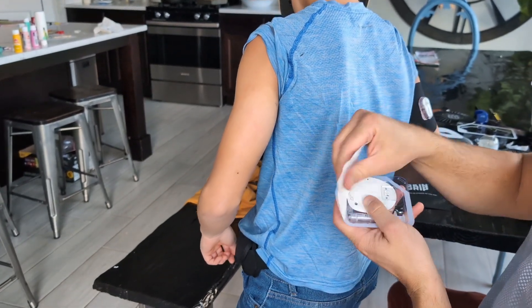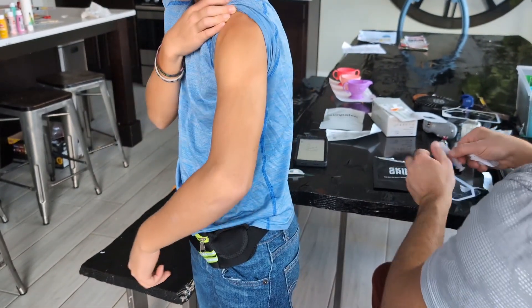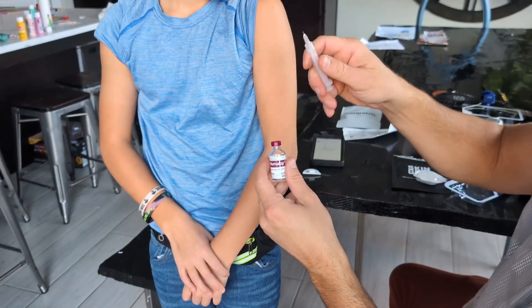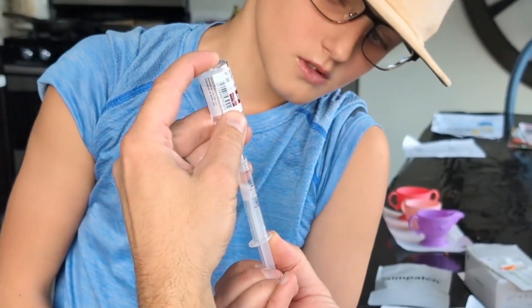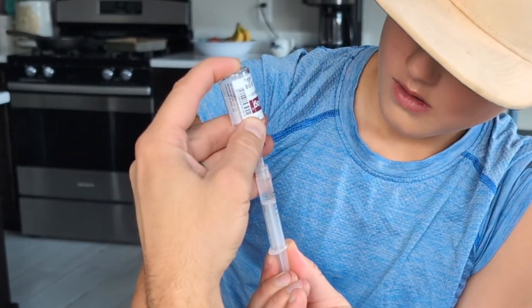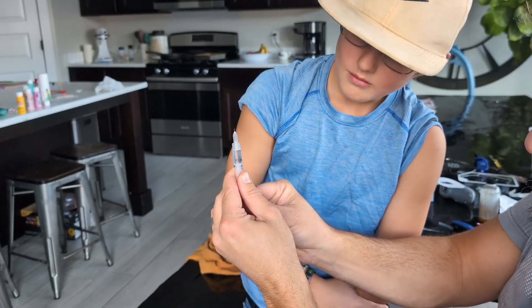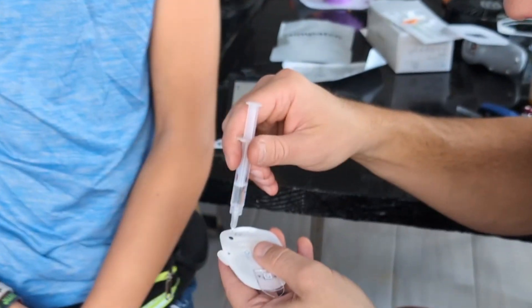The pod setup is a little bit more involved. On the Omnipod we've got the pump itself, a little syringe, and his insulin — this is a fast-acting insulin. I'm going to screw the syringe on there and pull out about 120 units. These Omnipods have a minimum of 80 units and will hold probably 200. We've never gone that far because he doesn't need that much. This only lasts three days and then there's an eight-hour grace period. Now we're not giving him this much insulin — that would not be good.